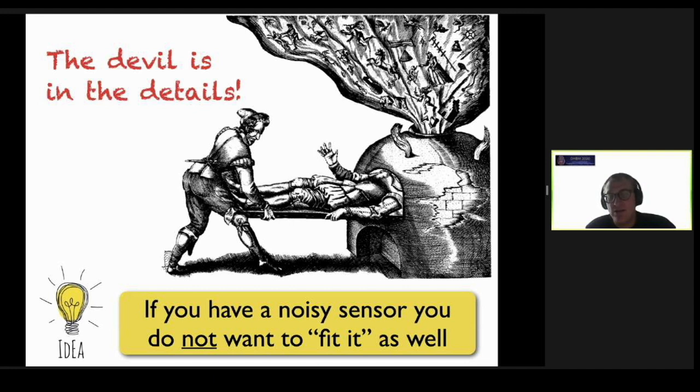What you can understand is that if you try to find the best candidate dipoles, and you try to approximate every sensor equally well, if one of these sensors is very noisy, then you're kind of shooting yourself in the foot. You should not give the same amount of credit or care as much for the sensors that are more noisy.